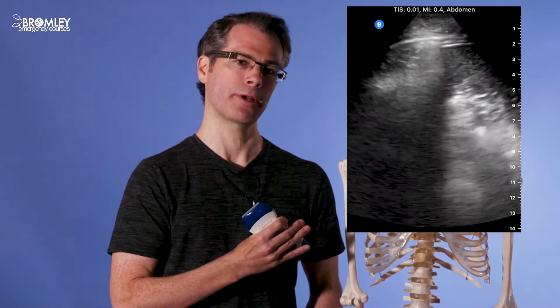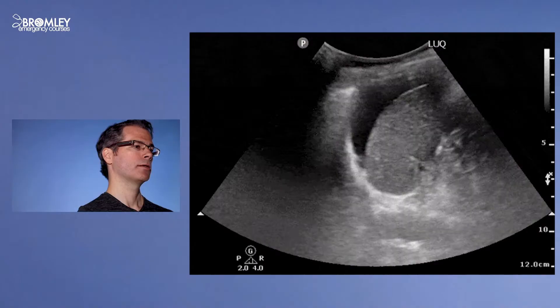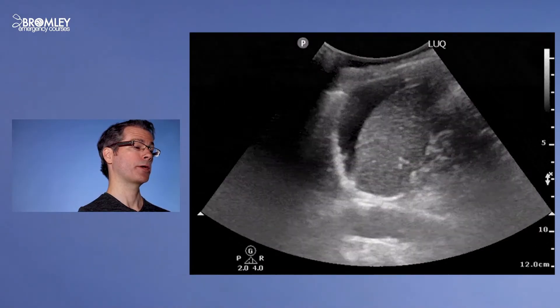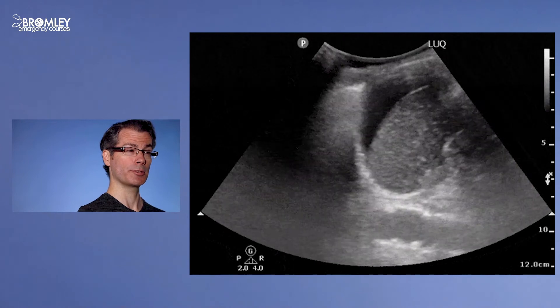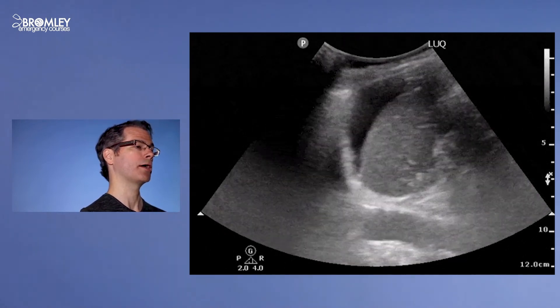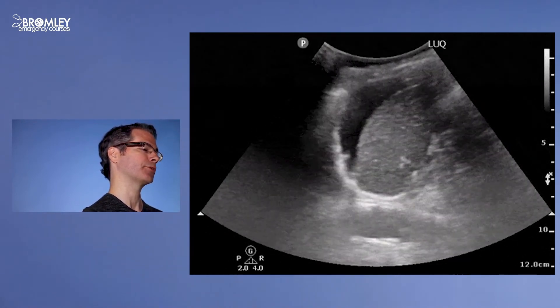Here's a video of a normal left upper quadrant. We have the spleen at the top of the screen and the kidney at the bottom, and now we're fanning through from anterior to posterior. Now we're going to slide up towards the thorax to look for any hemothorax, and then slide down to look at the inferior pole of the kidney — scanning through the whole region. Here's an example of a patient who has free fluid. You can see the black or anechoic area between the spleen and the diaphragm.